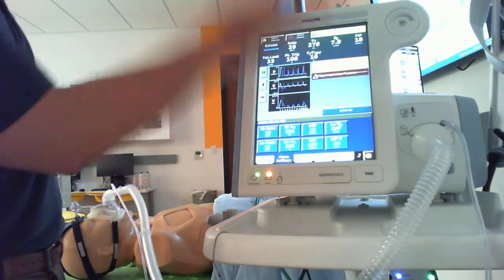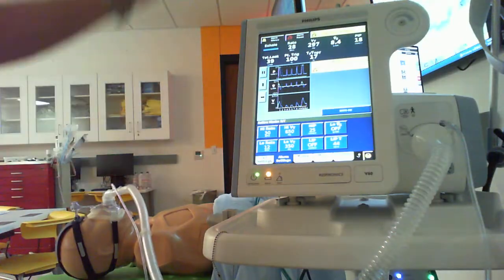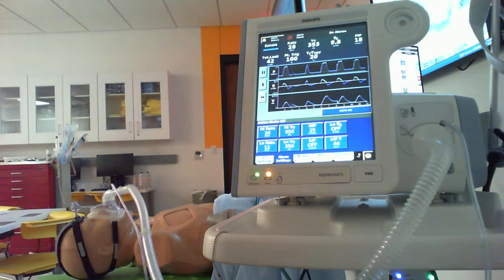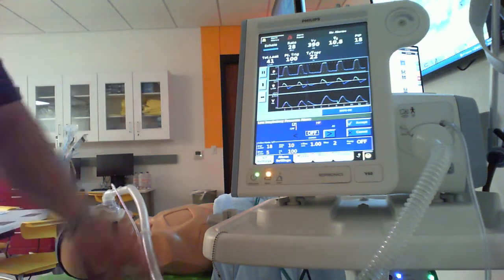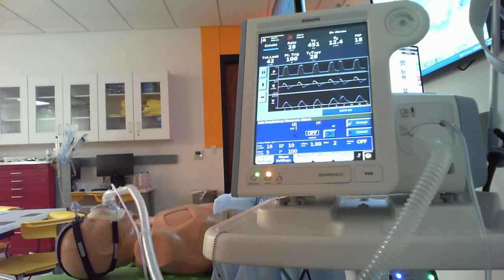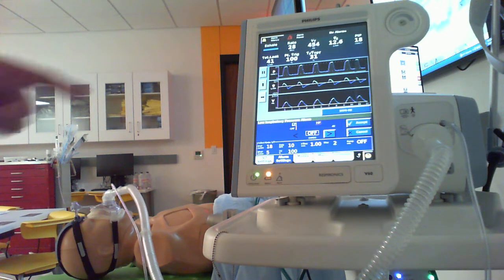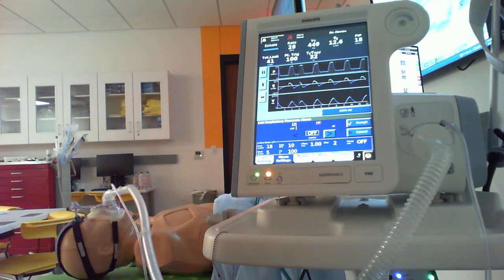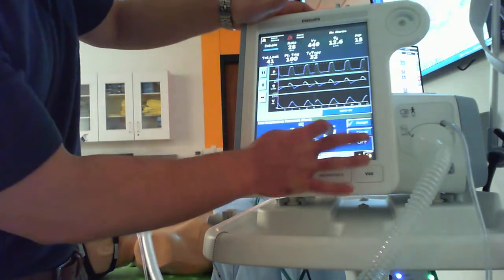I'm going to go ahead and hit silence. I'm going to hit reset, and you'll see it's going to allow my machine to go back to what settings I kind of had going on here. My low tidal volume alarm is also kicking off, which is good. LIP is important, okay? LIP is referring to the low pressure on inspiration. So what do you want to be alerted at if you're having trouble reaching our set pressures, okay? I like this really tight, 1 or 2 centimeters beneath what I have set.